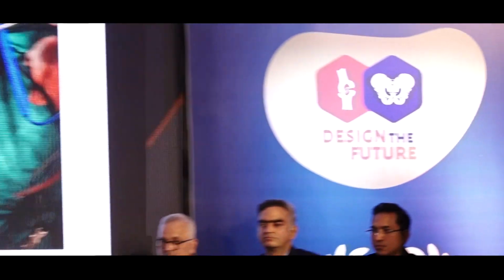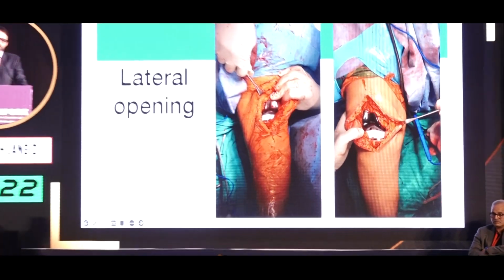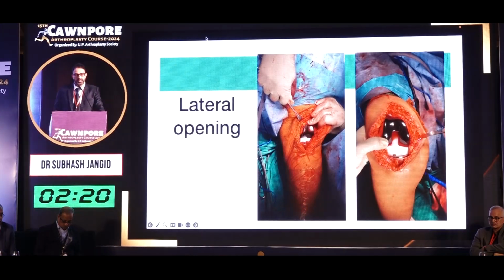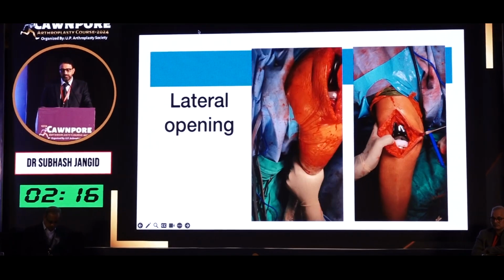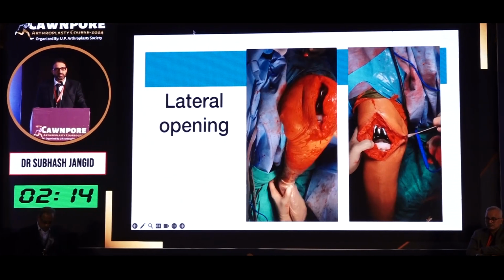Now, as you can see here, that's done by my colleague because we have a team. He finished this right one and said, it looks fine to me. As you can see in the lateral view, the video on your left side, there's a lateral opening. And so I said, no, we cannot leave this on the table. If we leave this on the table, it's going to progress.